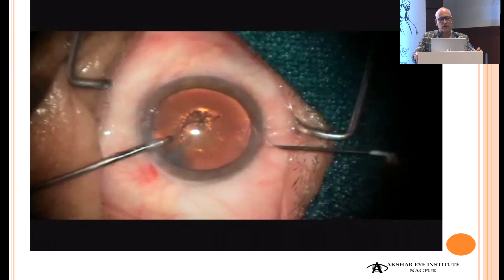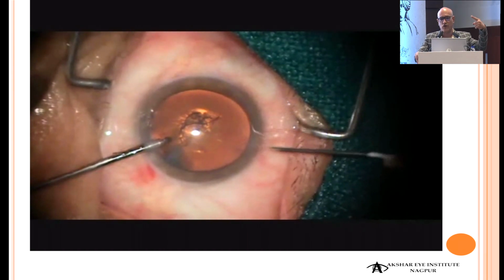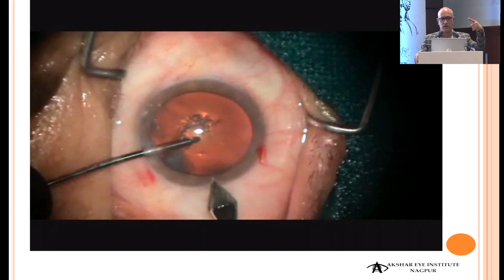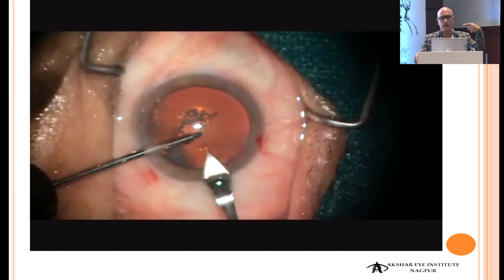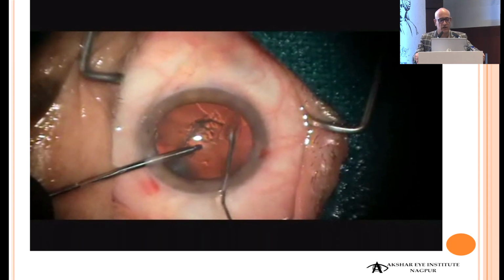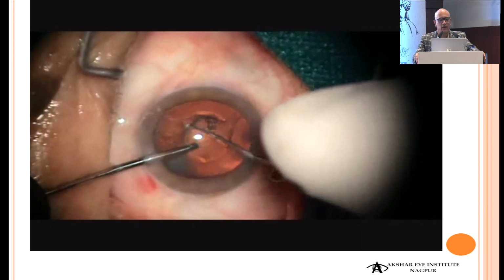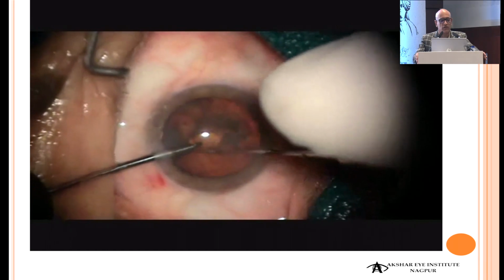The trick here in doing a capsulotomy is that you need to just change the direction of your irrigation so that the rhexis flap is everted. So this irrigating cannula directing the fluid towards the capsulotomy should be the main aim of directing the anterior capsular rim. Again, it should be everted. Now you just need to do hydrodissection from the side, and with the Sinskey hook you need to separate the nucleus from the epinucleus so that the nucleus is free.